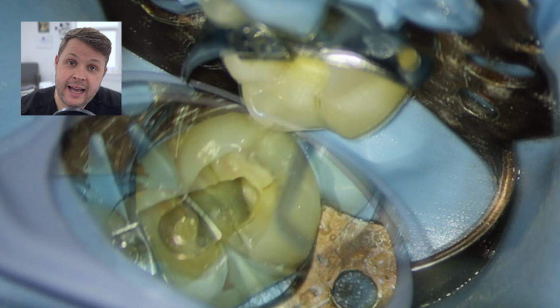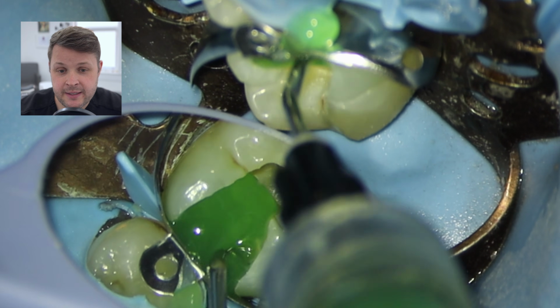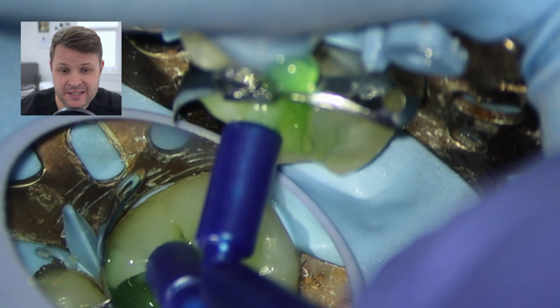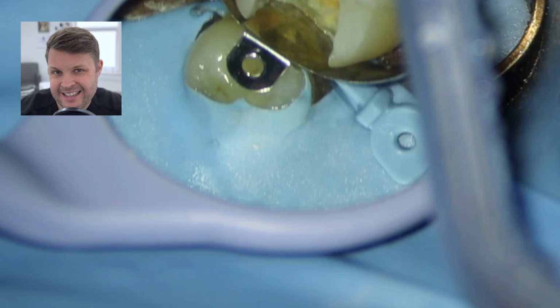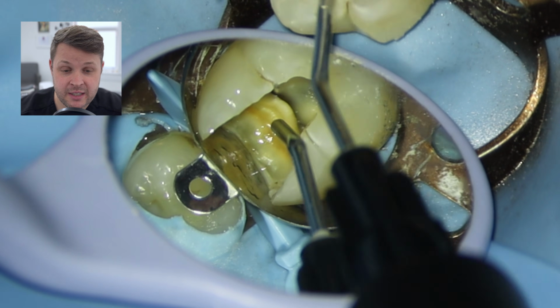And now I am ready to etch and bond this cavity. You'll notice here what I haven't done is protect the canal spaces. I feel like in this case, it's such a large cavity that I can do that without placing PTFE over the canal spaces.